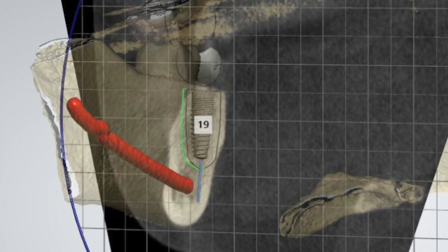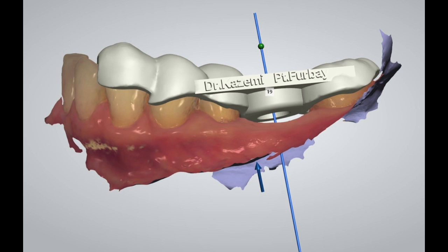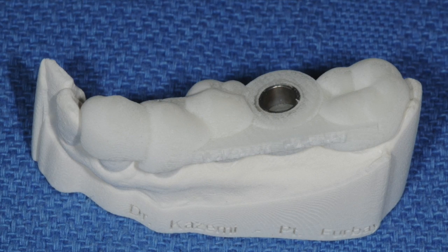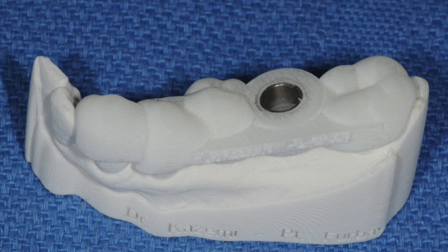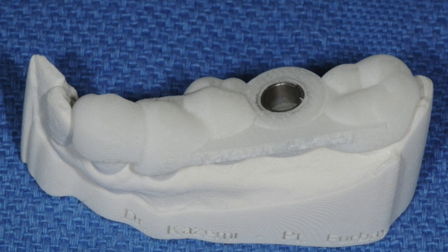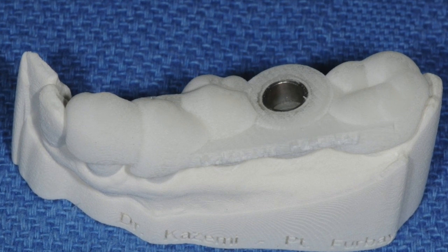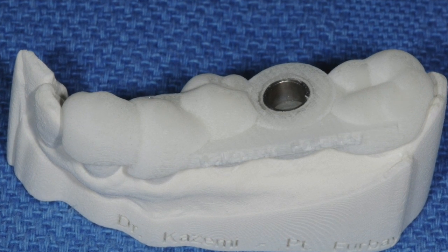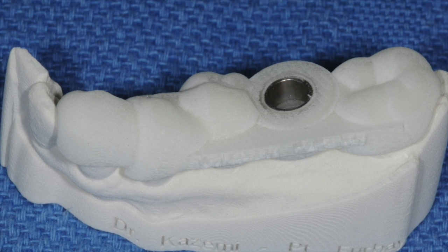Once the design has been approved by myself as a surgeon and by my team restorative dentist, we'll proceed with the fabrication of a CAD-CAM surgical guide, which essentially translates all the digital workup to a plastic guide used during the procedure for precise placement of the dental implant exactly according to the design.